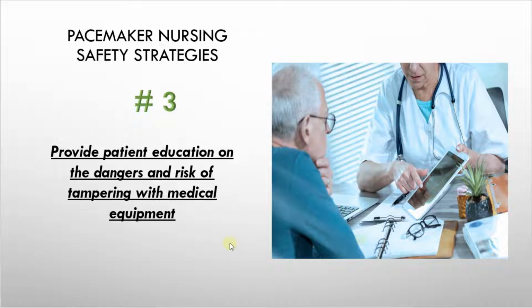Patient education is one of the crucial things that will minimize any tampering or playing with the machines. Not to say that the chances will be zero, but hopefully this minimizes it. Now, some hospitals might have a box or a plastic bag that goes over the temporary pacer as an additional layer of protection, but just be mindful that not every institution has that.